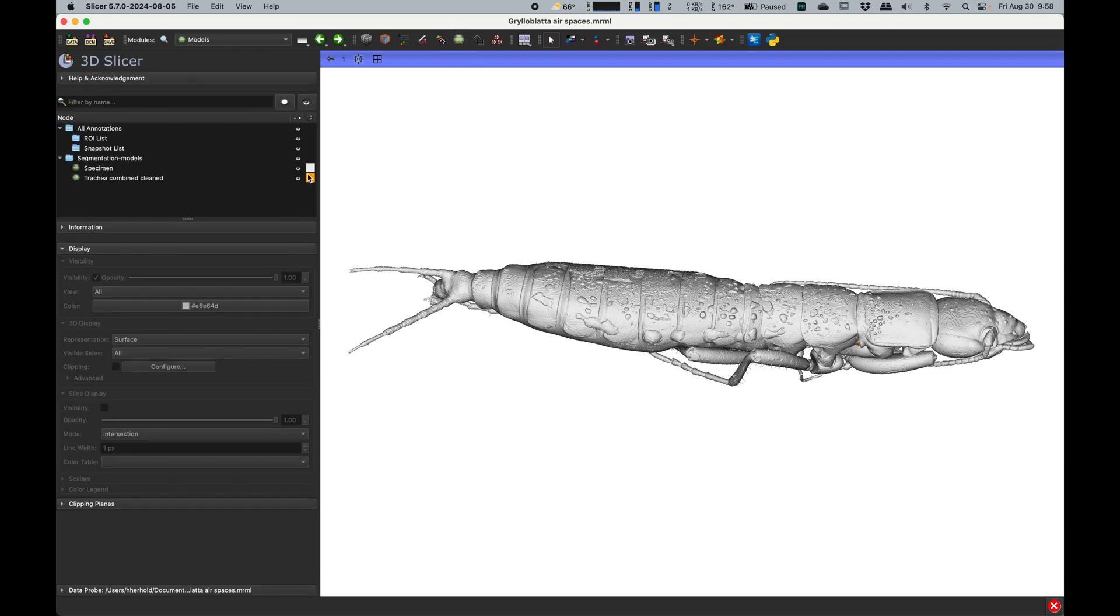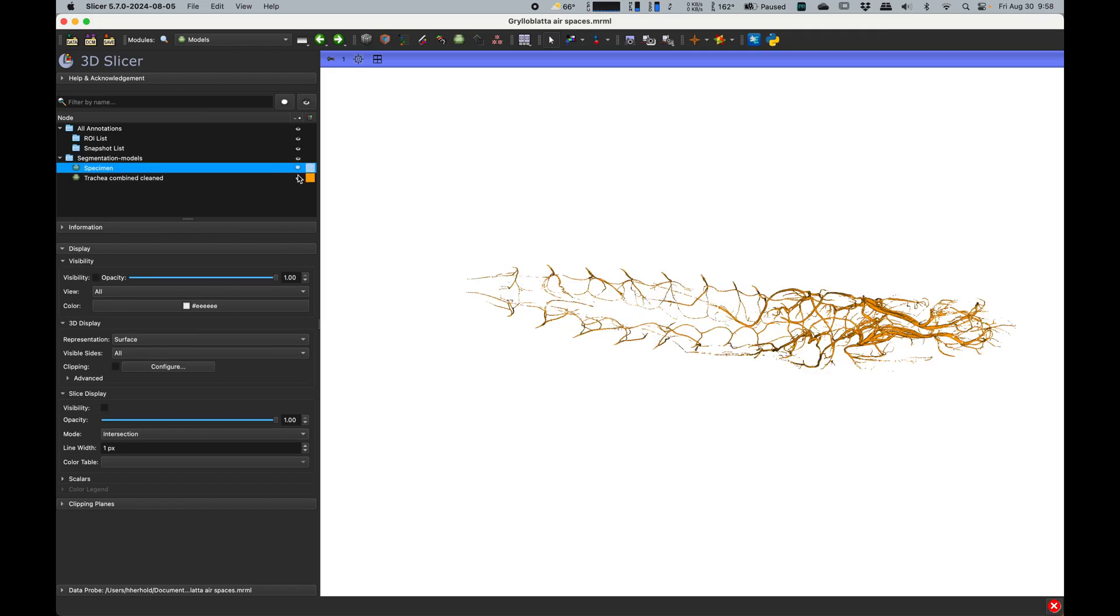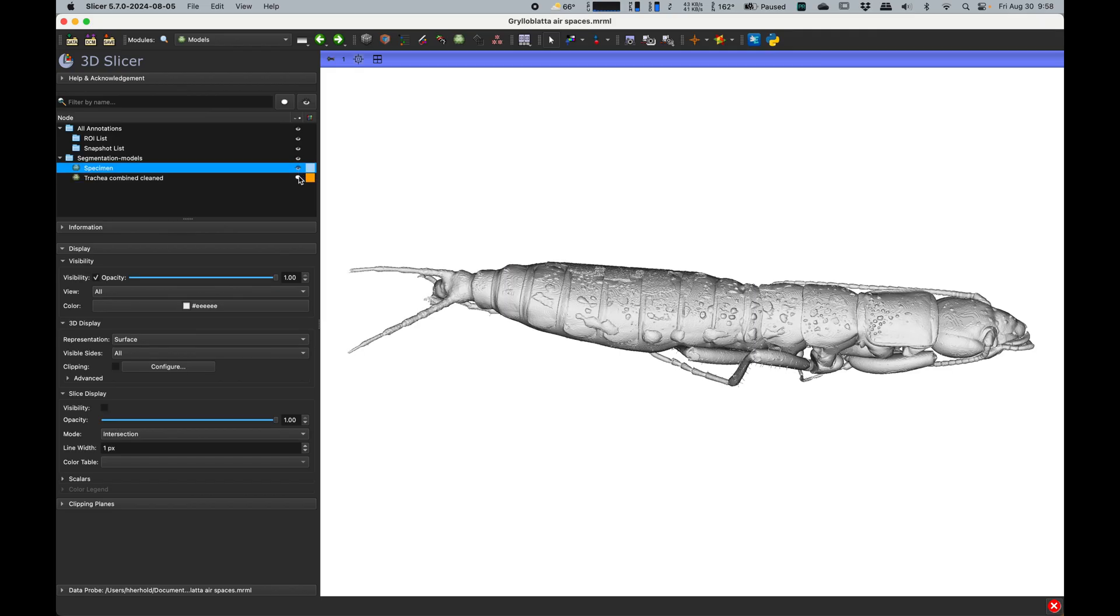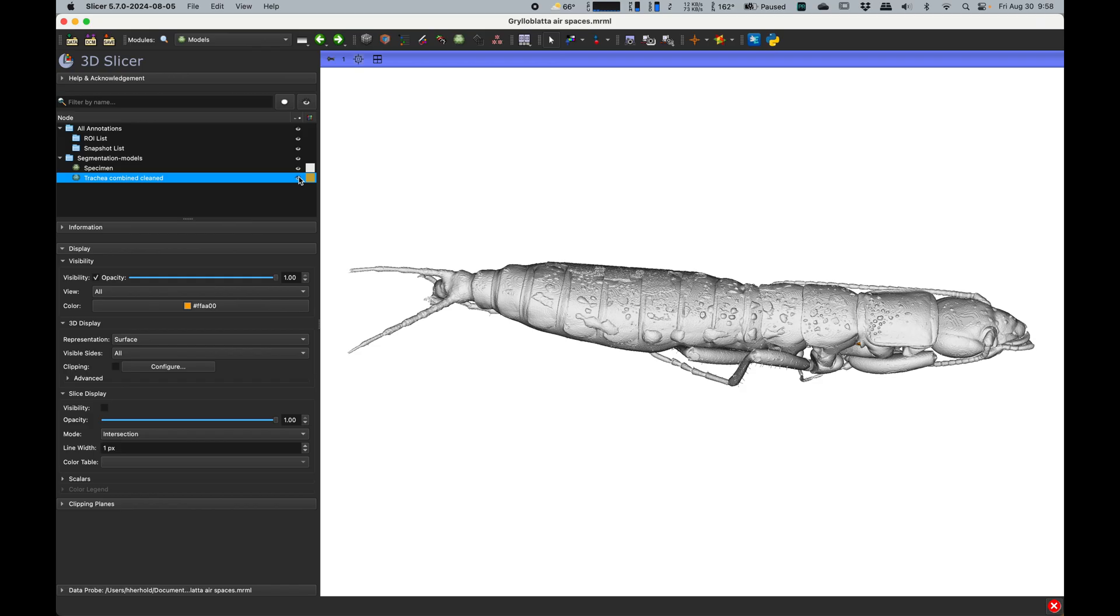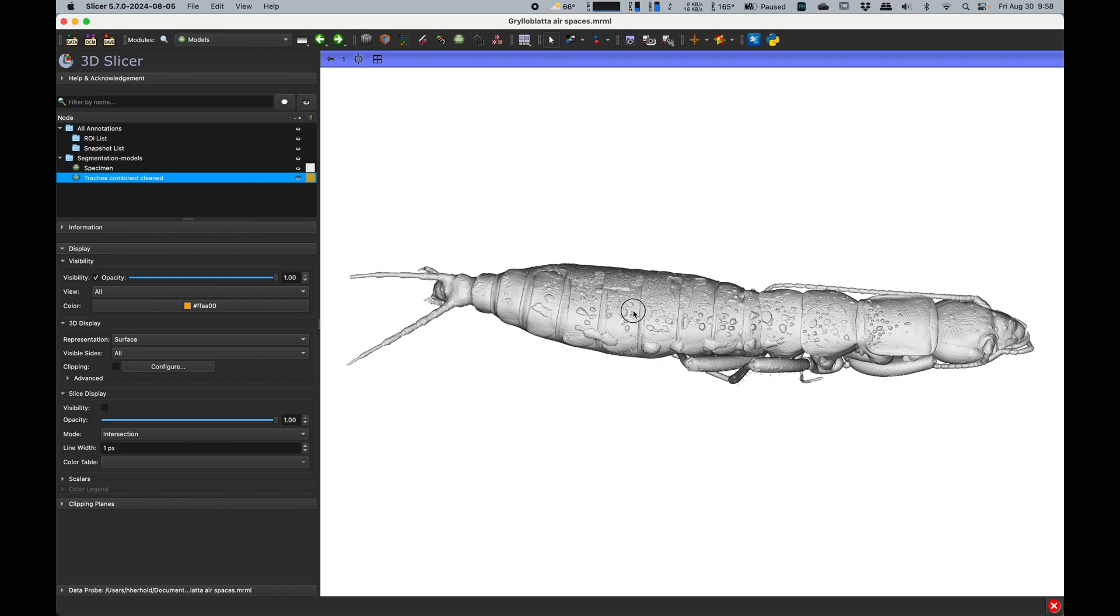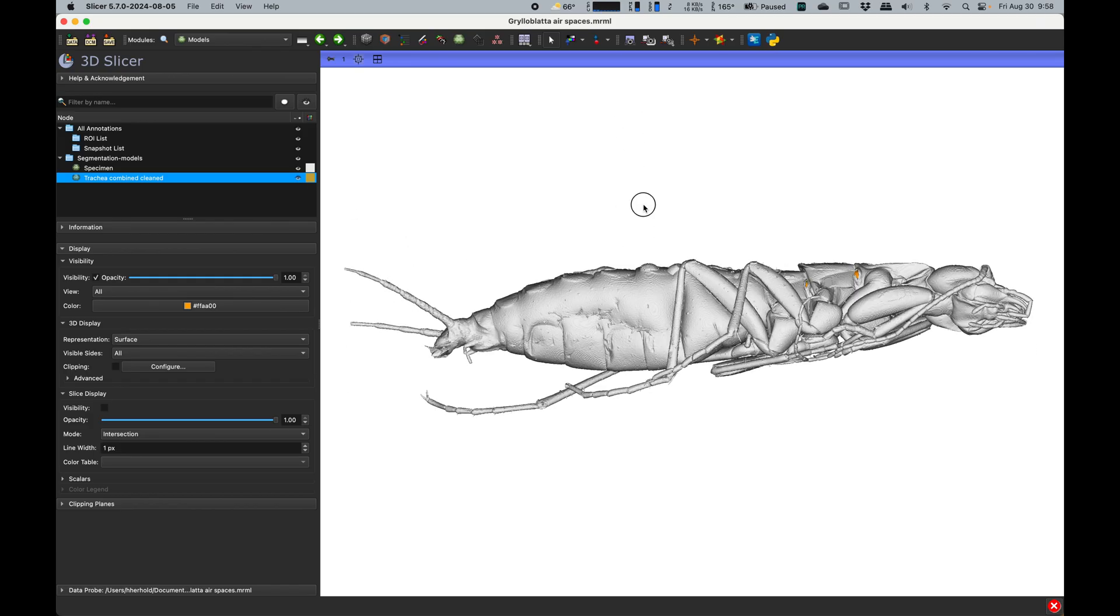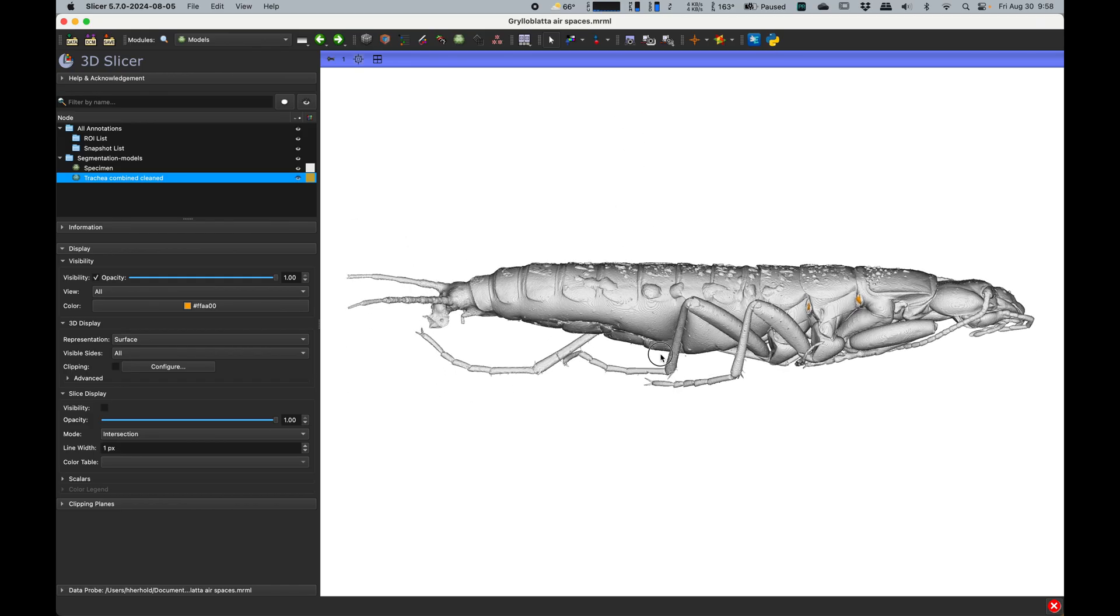So if you go into models here, there's two that are showing. We've got specimen and the trachea. So these are now our 3D models, not surface representations in the segment editor or segments. These are models that can then be exported.